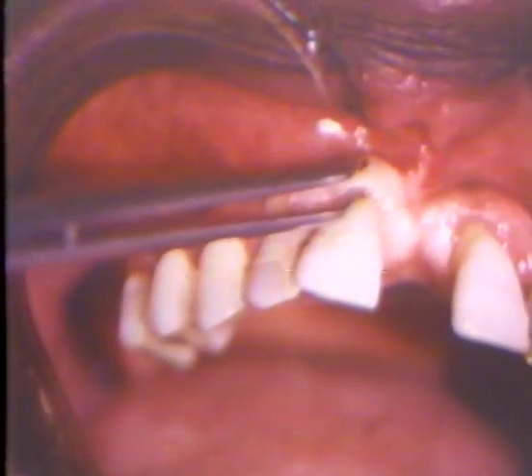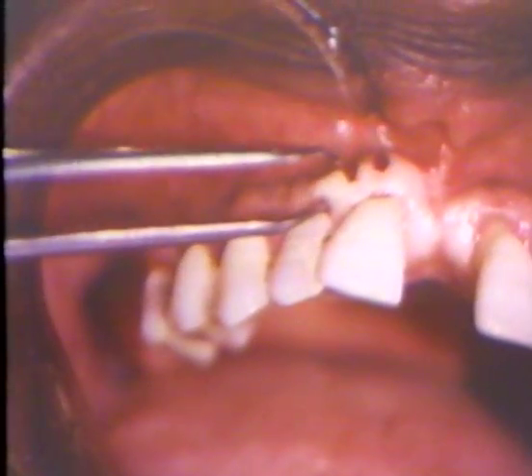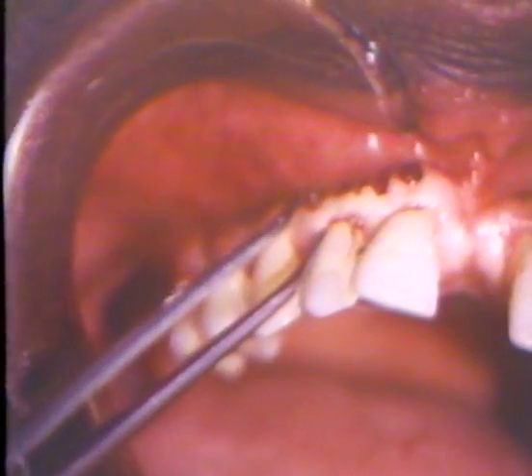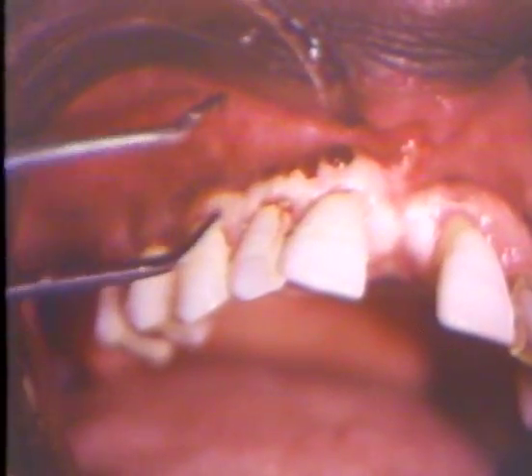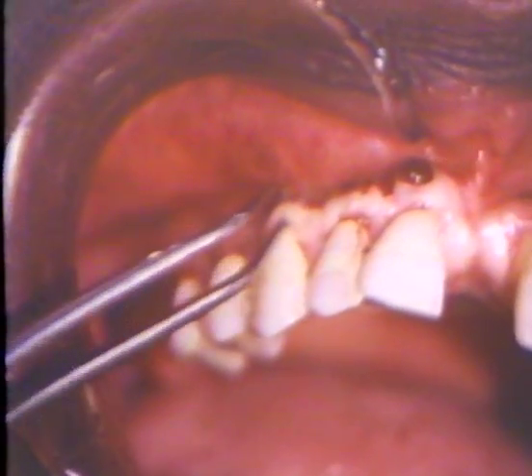With this Crane-Kaplan pocket marker, three markings are made on the labial mucosa overlying each tooth. The purpose of using pocket markers in the apically repositioned flap is to enable the clinician to determine the location of the base of the pocket and the crest of the alveolar process.